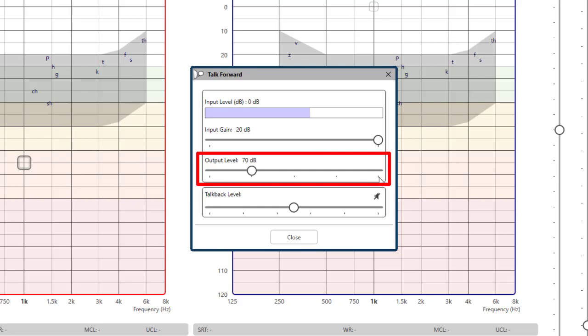The output level is your volume level to the patient using your operator headset boom mic. You can adjust the volume by sliding the output level control.